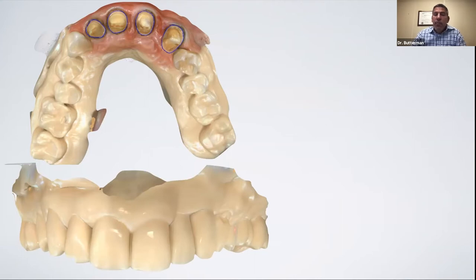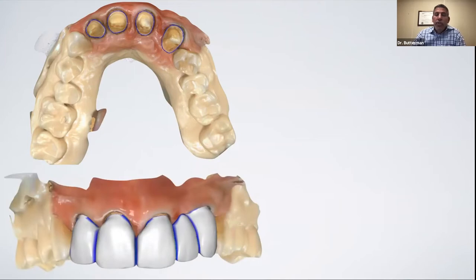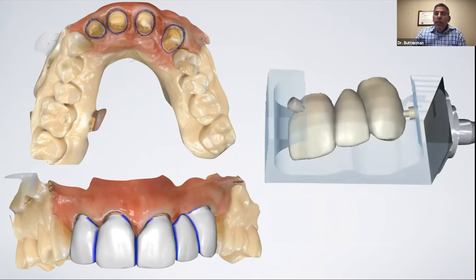So that just makes this case really easy because we're just going to do this as a biocopy case. So now just using his diagnostic wax up, it's just a matter of drawing copy lines and moving through and getting our proposals. And really the only thing I did on his proposals here was tweak the pontic a little bit and adjust the contacts. So again, with the Katana bridge, those layers of translucency become even more important because I want to be able to have some incisal translucency with this. If I don't have any incisal translucency, then the case looks dead. It looks flat. It just doesn't really pop.